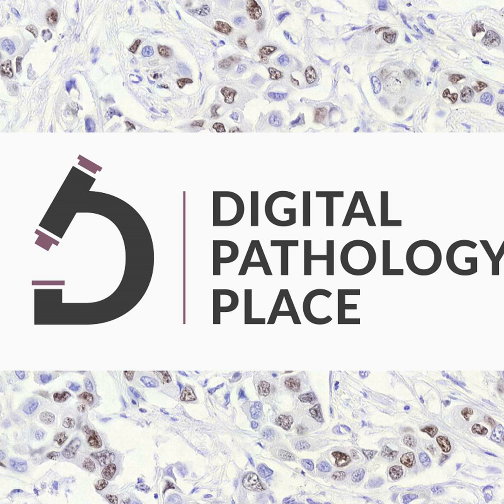Second, accuracy. They hit their target of being a highly sensitive screen, achieving a 0% false negative rate at the slide level. It didn't miss any positive slides. Perfect for a screening tool. Exactly. And third, usability. That pathologist confidence survey score, which was low initially, after the improvements, it jumped to an average of 2.93 out of 3, comfortably exceeding their 2.7 target. They also checked throughput. Average analysis time was under 2 minutes, well below their 5-minute requirement. So it hit all the marks. Yeah. Faster, accurate enough for screening, and the pathologists were happy using it. Right. That sounds like a successful validation.